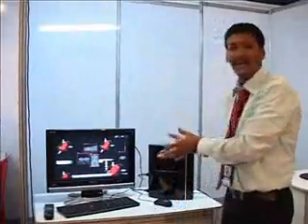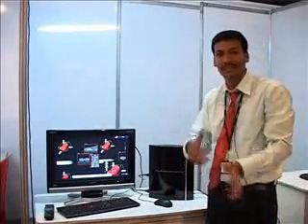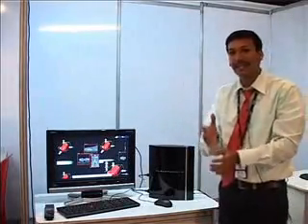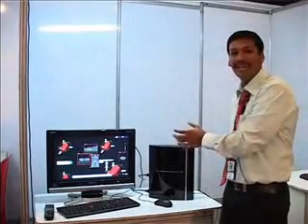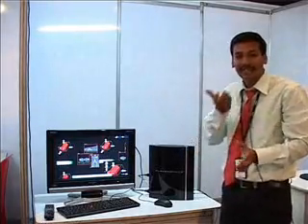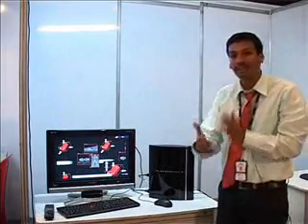This is what we have implemented on the IBM-CELL in order to improve the performance over a normal CPU. As I said, we are doing interpolation in order to generate a virtual slice. If we do it on a normal CPU, we have to process each pixel one by one, but by using IBM-CELL, at a time we can process a chunk of pixels, because this IBM-CELL has 6 SPUs, which are SIMD cores capable of doing parallel operations.